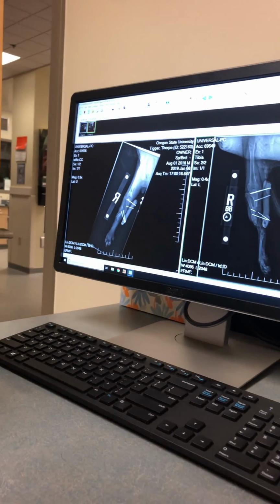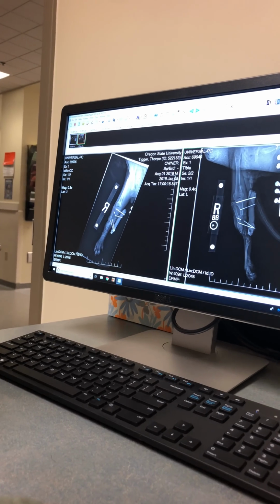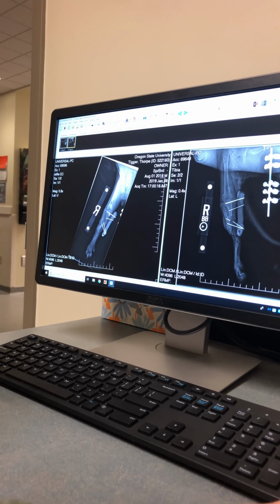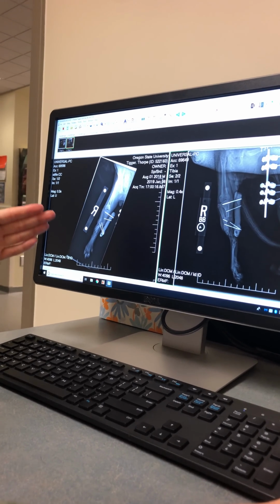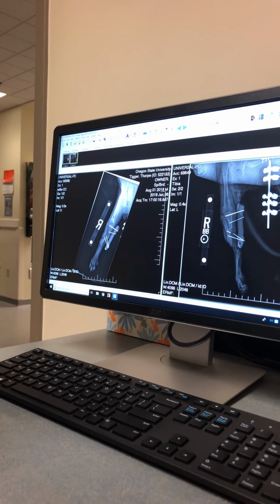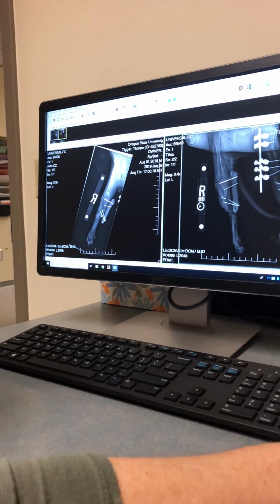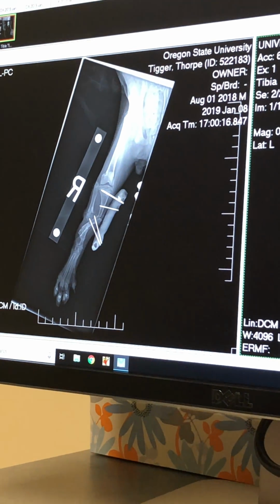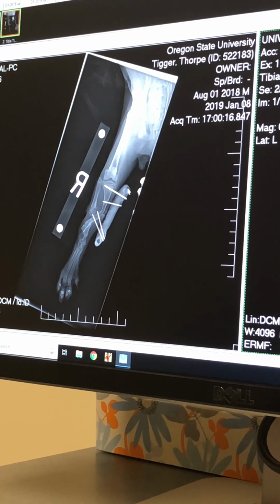Surgery was, he only had part of a tibia and more of a fibula, so they cut the bottom of this and brought it over to recreate a weight-bearing axis, so he had one bone that would transfer the force from his femur down to his foot. And so that was an external fixer with pins going through, and then basically bone cement on the outside.